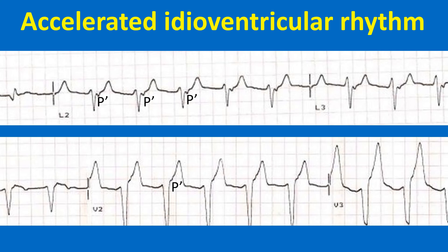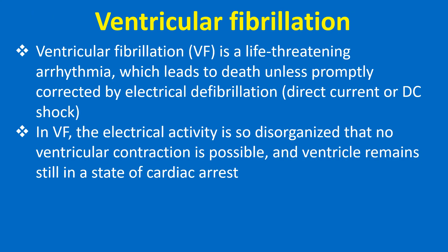ECG strips show accelerated idioventricular rhythm. Regular retrograde P waves are seen in the upper tracing. In the lower tracing, retrograde P waves manifest as a slight irregularity in the upsloping ST segment.